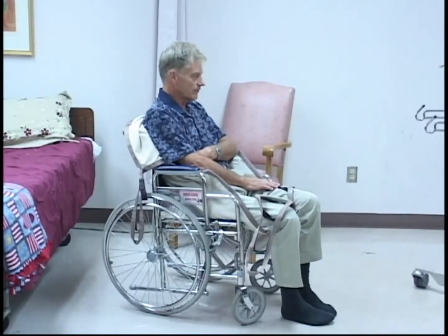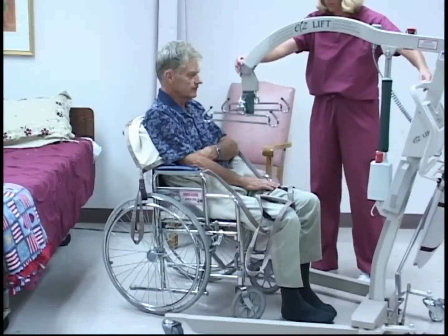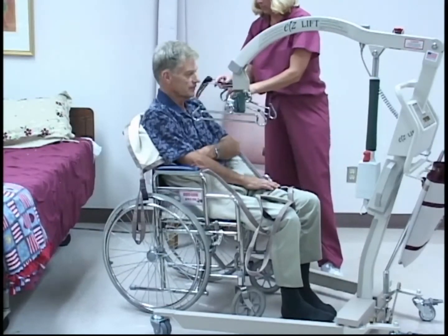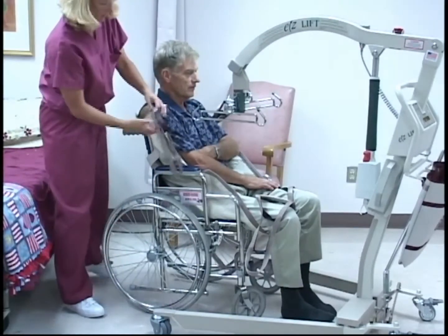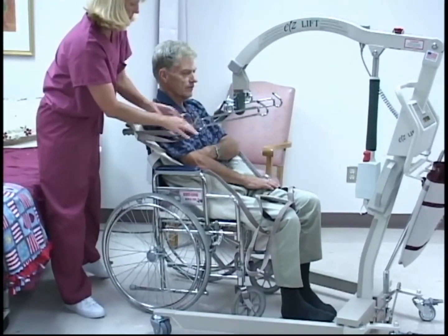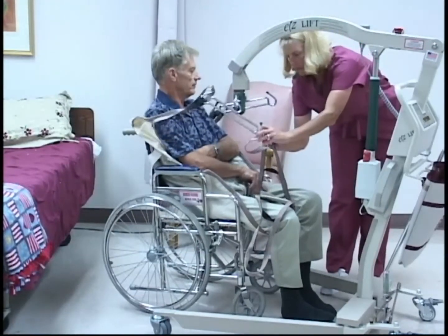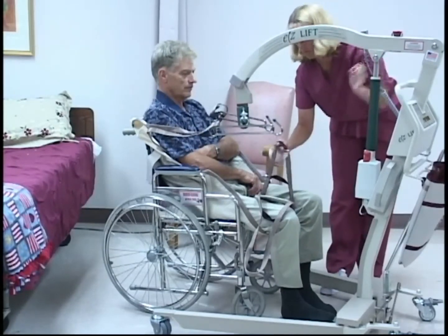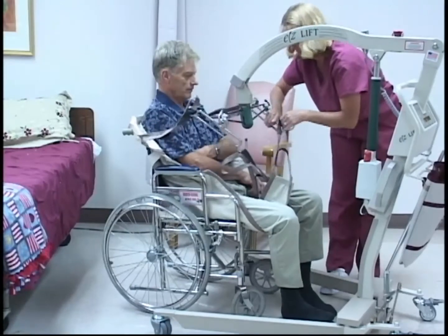This procedure will ensure that the sling is under the patient's bottom, with the patient's weight evenly distributed on the sling. Use the spreader bar to spread the legs wide enough to straddle the wheelchair. Position the lift so that the green rubber nose is now in front of the patient, with the hanger spreader parallel to the patient's shoulders. Attach the lift shoulder strap to the left hook and the right shoulder strap to the right hook.